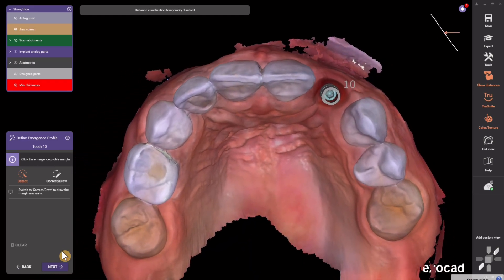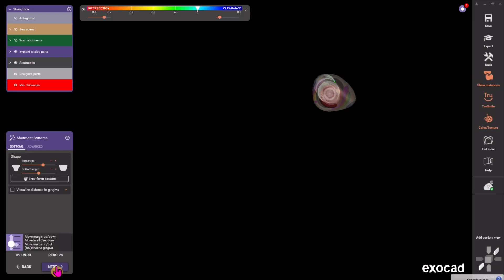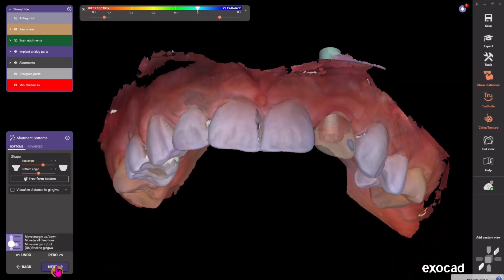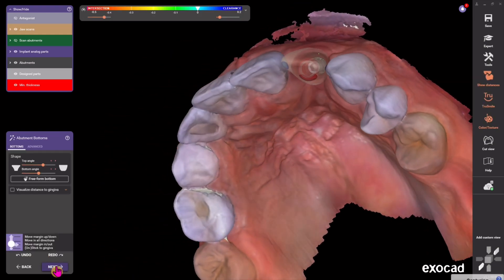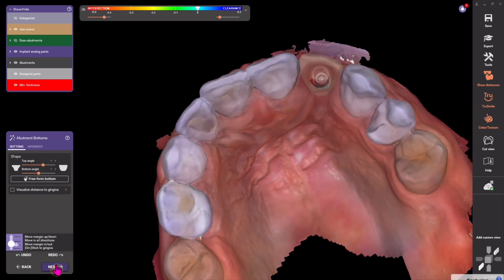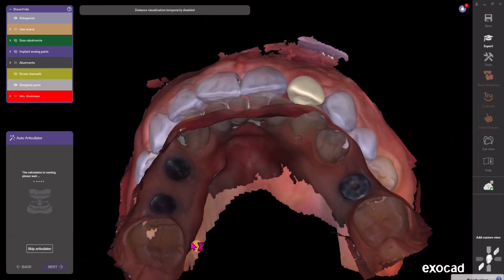This is an optional step so I usually just hit Next here. It's a step where you could define the subcritical contour line, and then another optional step where you could define the emergence profile of the soft tissue. This is a step that I just usually skip.